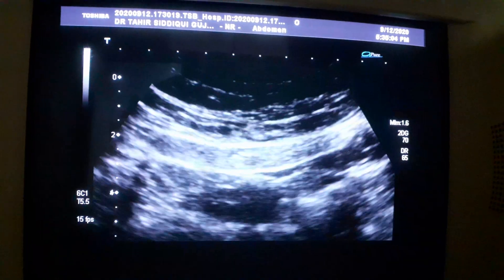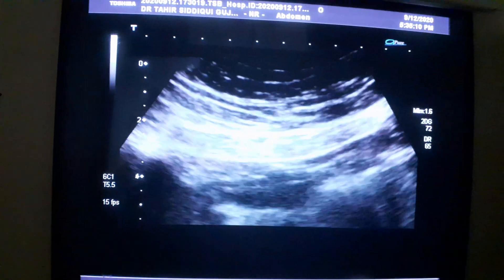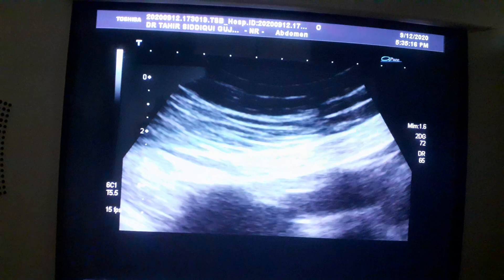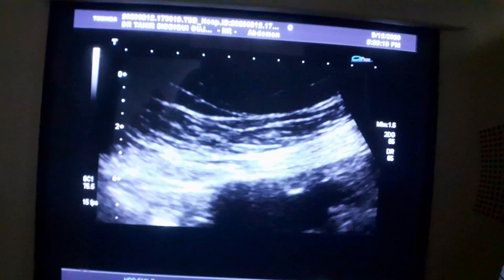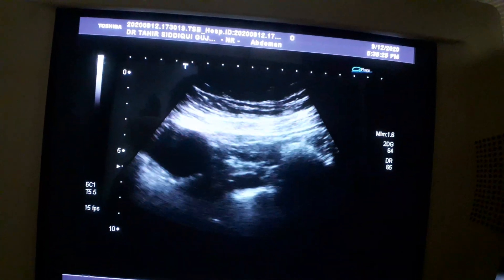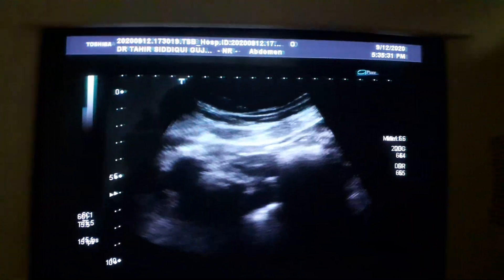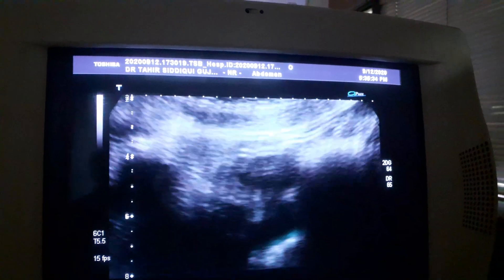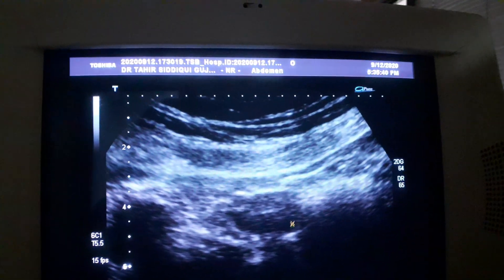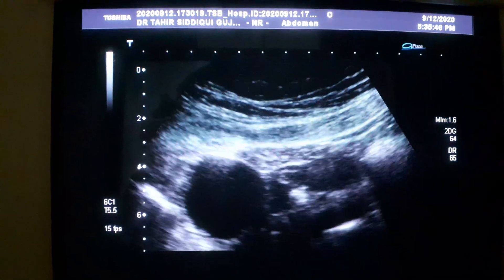This is the ovary — you can see it separately from the cyst. This is the right ovary, and this is a follicle being formed within it. Because the ovary is seen separately from the cyst, this cyst is in fact a paraovarian cyst.